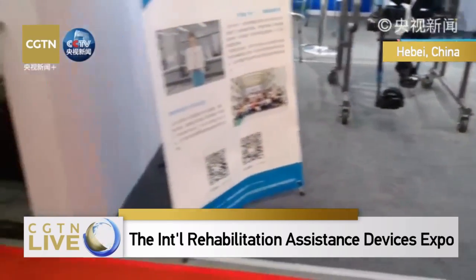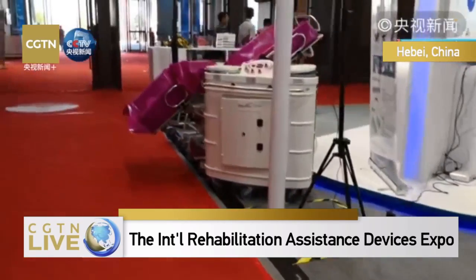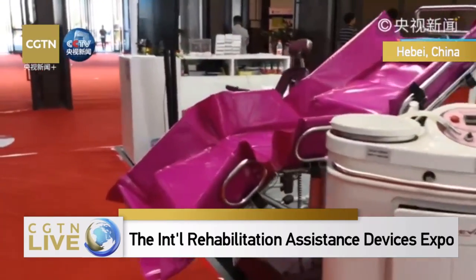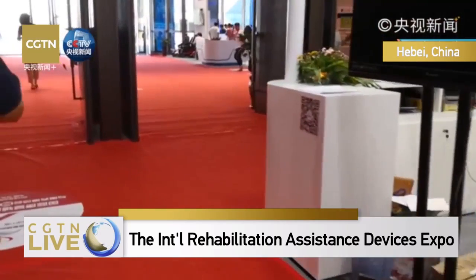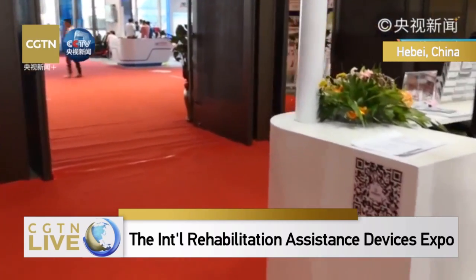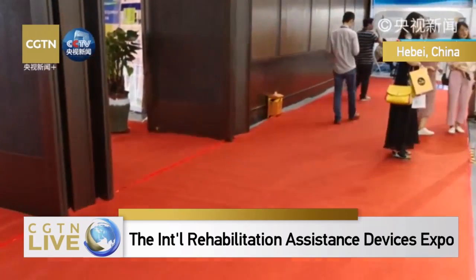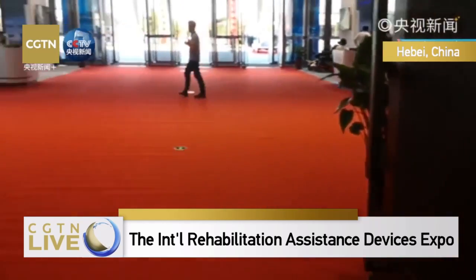The exhibitor just told us one very important factor, that is, through these devices, it can help the patients to restore their motor function and status. It can also restore and improve their pulmonary functions.